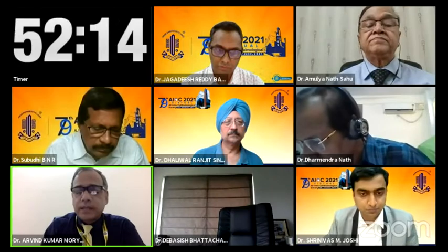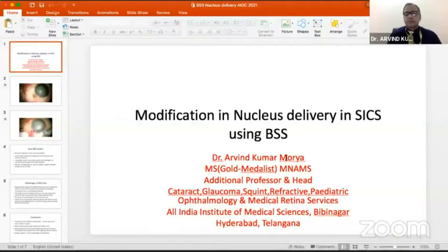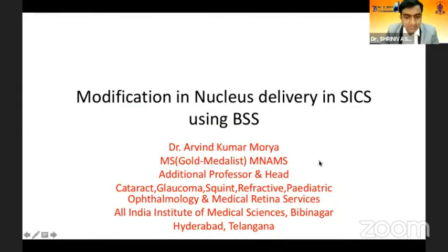Okay, I will start sharing my screen. Is it visible? Yes. So I have two videos on the modified technique of nucleus delivery in SICS using the balanced salt solution.